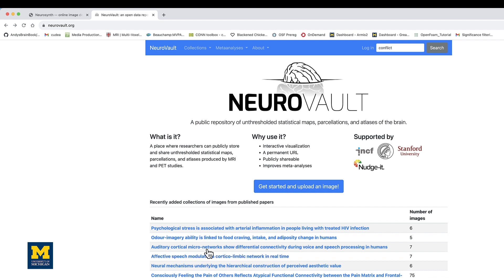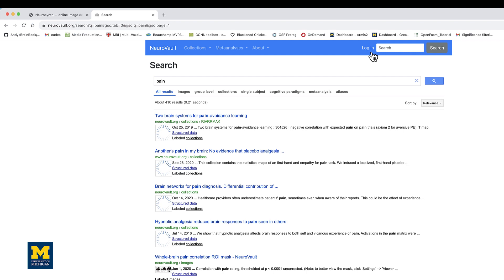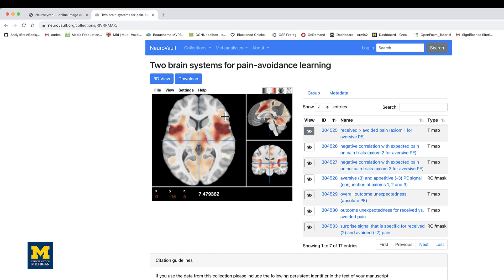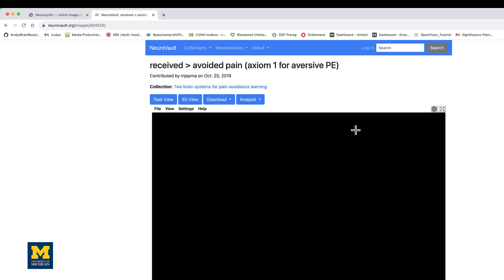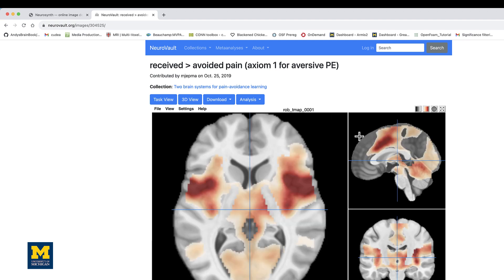We could, for example, search for a term like pain and then select any of the results that are returned. In this case, let's select the first one: Two Brain Systems for Pain Avoidance Learning. Within this, you see a series of different group level activation maps, t-maps to be specific. Let's click on the first one, received compared to avoided pain. This will display a group level map for that contrast.